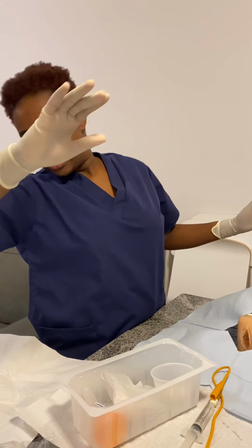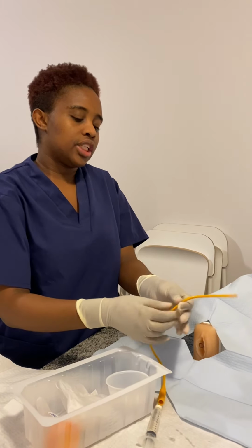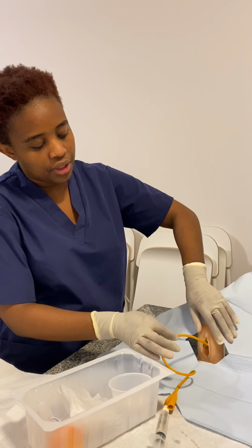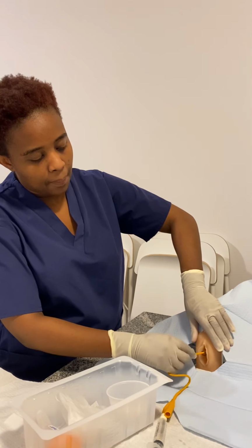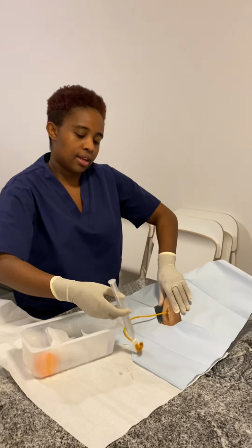Okay, so now I'm going to insert the catheter. I have to make sure that when I'm inserting the catheter, I touch it 3 or 4 inches from the tip. So this hand is contaminated. That means I have to still keep it here. So when I see the urine is flowing, I have to make sure that I advance my catheter 2.5 centimeters. So now I can go ahead and inflate the balloon.